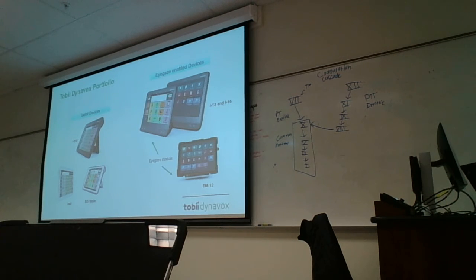We also have the Indie and the Indie 7. I have the Indie 7, which is the smaller tablet over there. That's touch or switch accessible. And then the I-110 is the smaller black one there, and that's our touch or switch accessible device that's most durable. They do drop testing on it, there's Gorilla Glass on the front, and it's also water resistant.